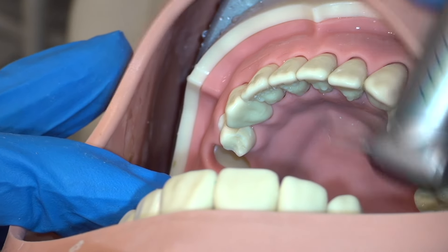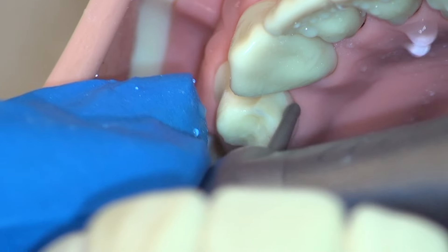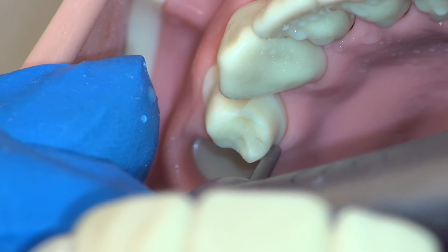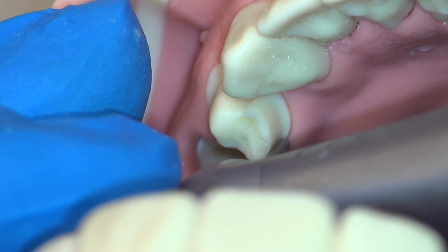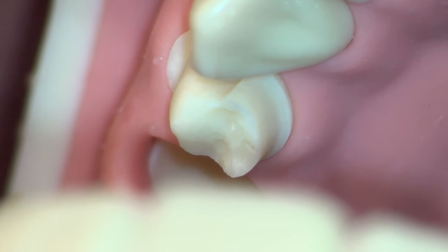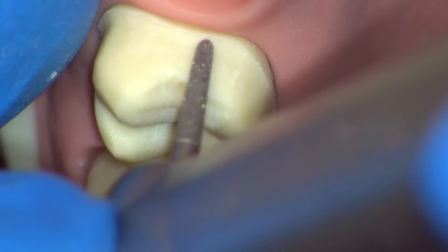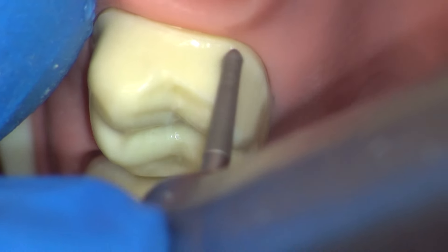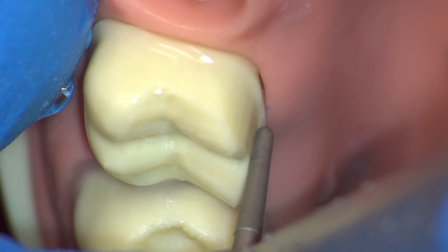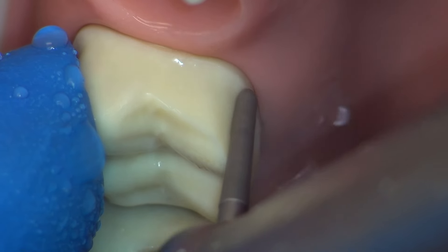Looking now to our lingual view, we'll turn the head to the left. Viewing our lingual surface, we are still looking roughly from the occlusal of these teeth and looking past the maxillary central incisors. We'll go ahead and copy-paste our angulation from the buccal to the lingual to ensure we have a good TOC and work carefully around. Because of the minimal reduction of the lingual with the chamfer, we can actually do this entire reduction with the red diamond burr. Refine the finish line to the final desired depth immediately. Continuing to the lingual of our molar, we'll take our angulation from the lingual of the premolar, from the mesial of the molar, and then begin to work around the lingual of the molar — copy-pasting our angulation from the buccal-lingual and from the mesial-distal directions. As always, we work sequentially from one side of the tooth to the other, and we can re-take those angulations again from our source angulations.